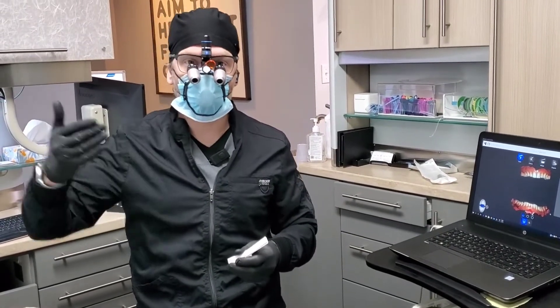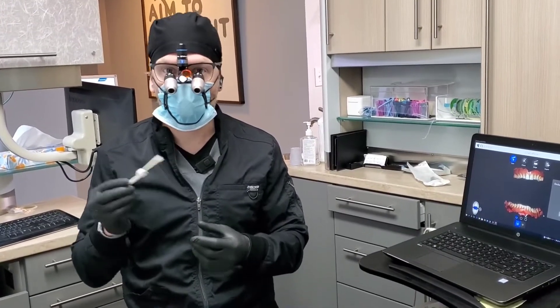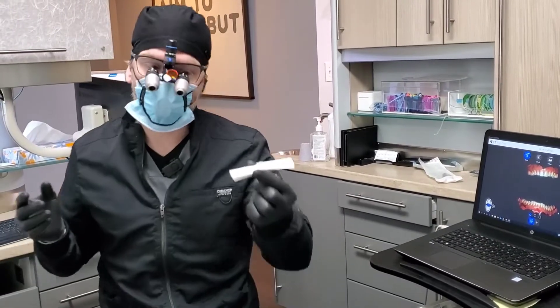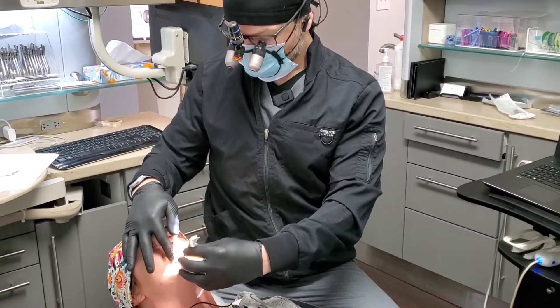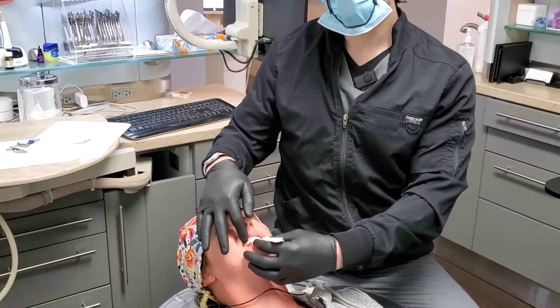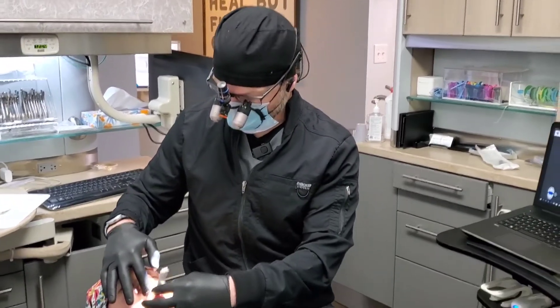So if you want two millimeters in the back, you're looking at four millimeters of opening on an articulator. Now, we're not doing that — we're putting these little leaves between the teeth. So it's not easy to say I always want four millimeters, because how deep their bite and how their anterior coupling can vary. But that's what I'm starting with — about two-thirds of the leaf gauge. I tell them: close together, slide forward, slide back, squeeze. I do that about five times to get a true centric relation bite, trying to relax those muscles and the joint. Not forcefully — go forward, go back, and squeeze.